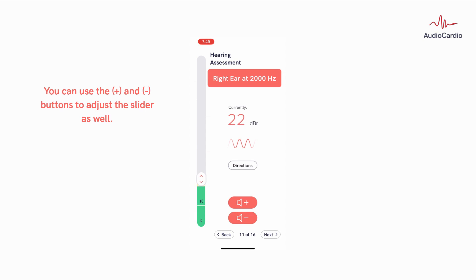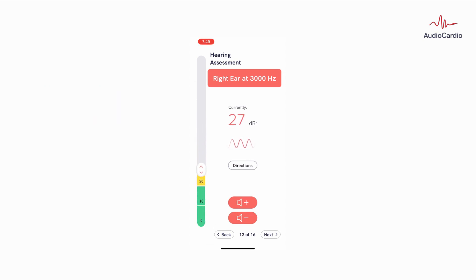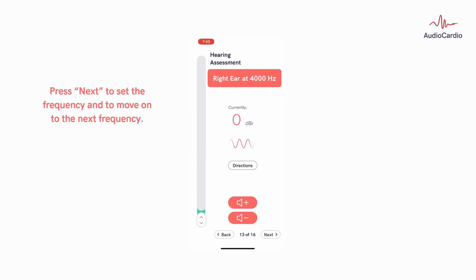You can use the plus and minus buttons to adjust the slider as well. Press Next to set the frequency and to move on to the next frequency.